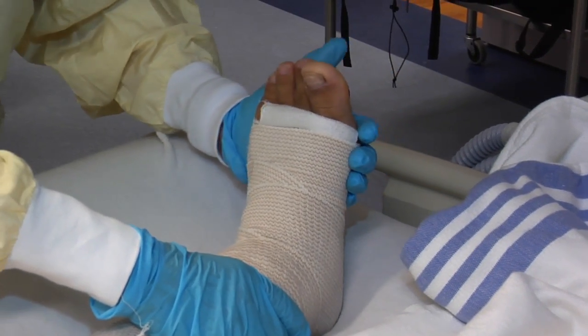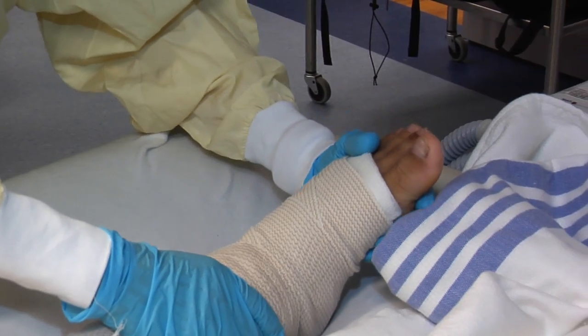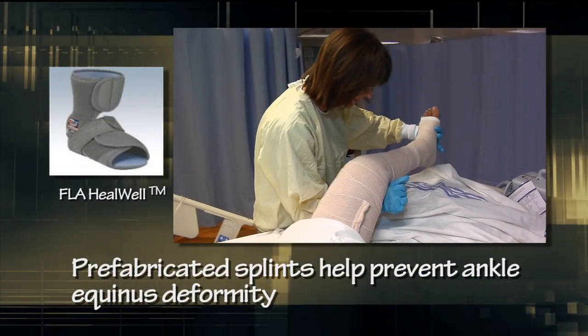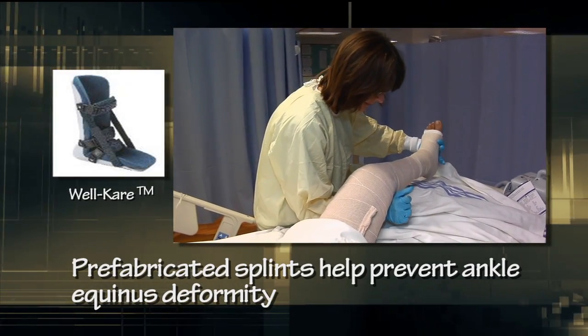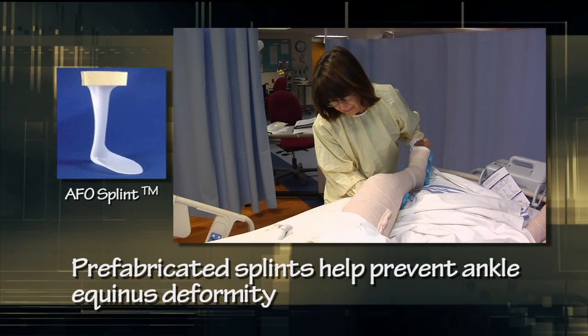Multiple modalities can be used to maintain the talotibial joint at 90 degrees and prevent ankle equinus. Prefabricated static splints are readily available, non-invasive, and easy to apply and remove, thus facilitating dressing application. Custom fabricated thermoplastic splints may also be used.